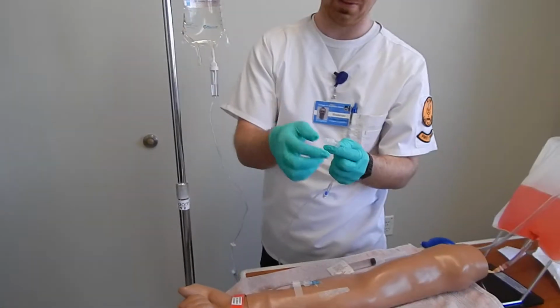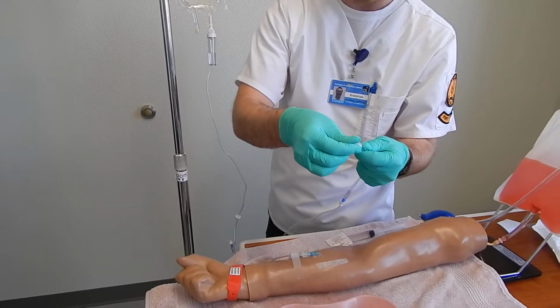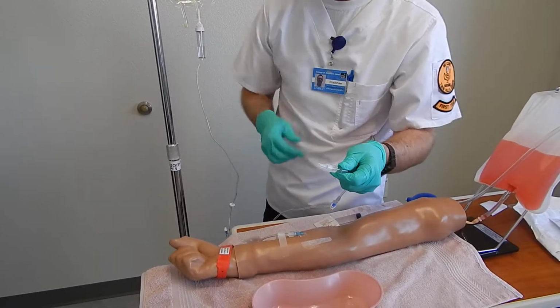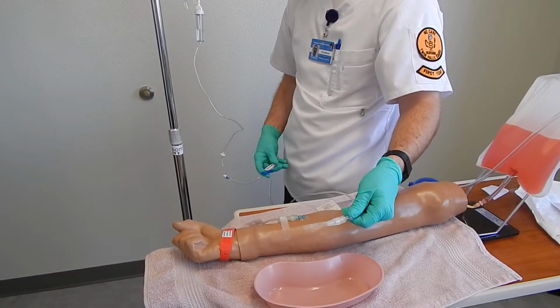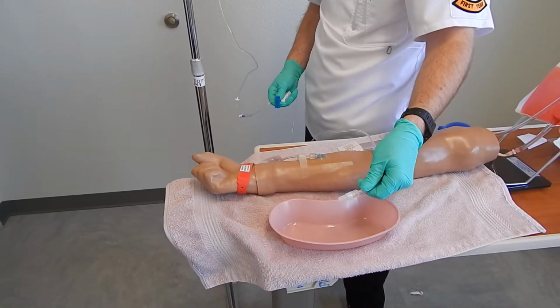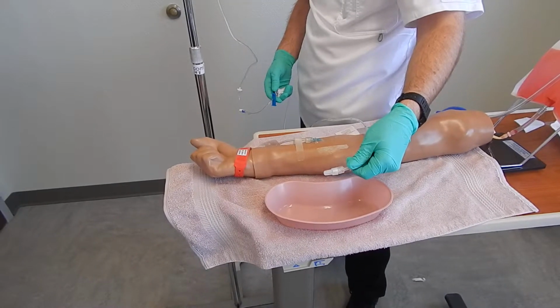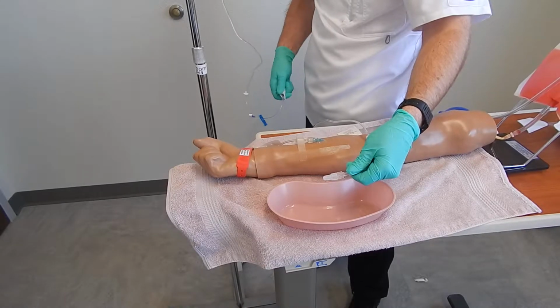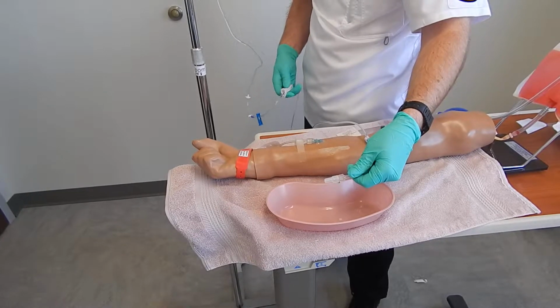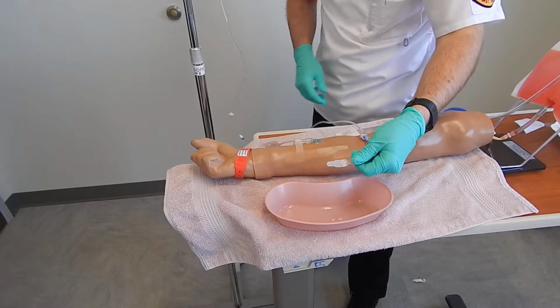And then with this little filter part at the top, I just make sure that it's loose so that the saline can come through. I'll go ahead and open that up. So close that for a second.